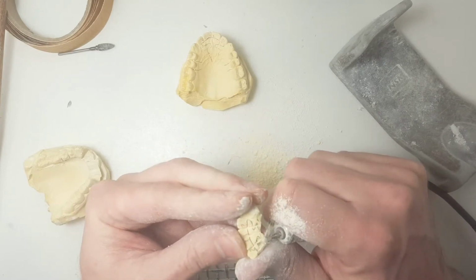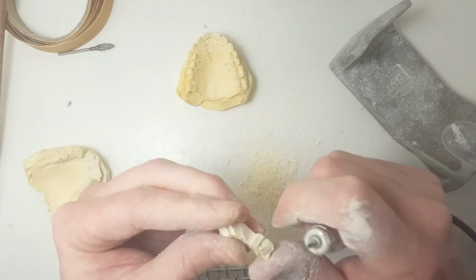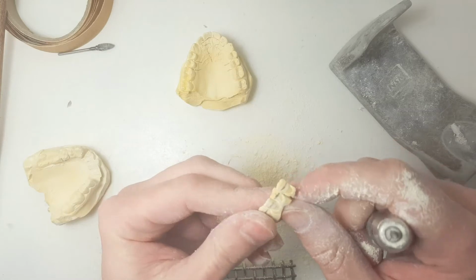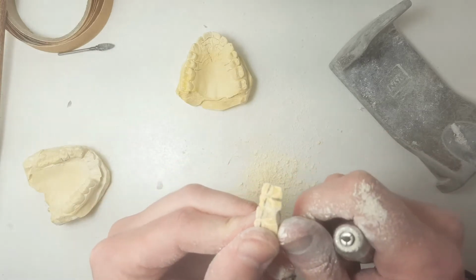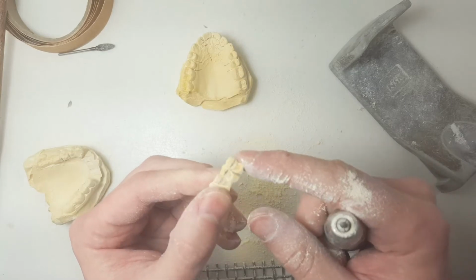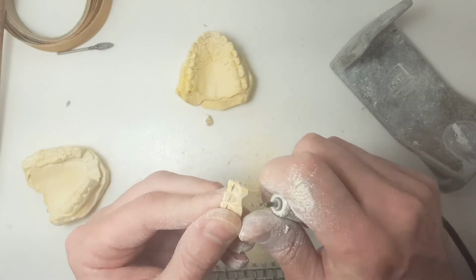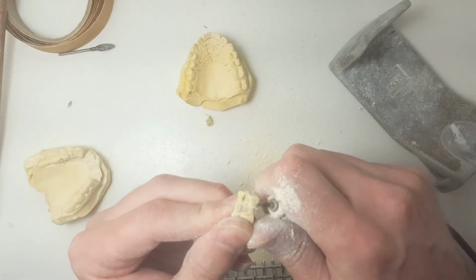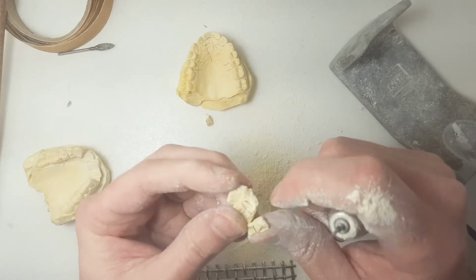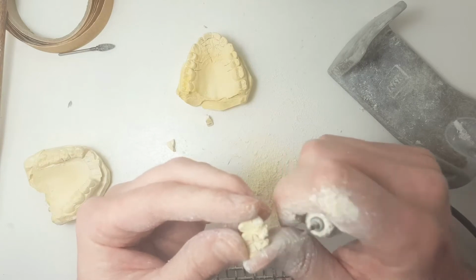Oh, let me explain what I'm doing here. I am just slowly cutting out the tissue section. Hopefully you can see that. So then it should be able to break off. I'm just trimming out the tissue section, trying to leave as much tooth as possible. Sometimes they break off easier. And just keep going down the line.